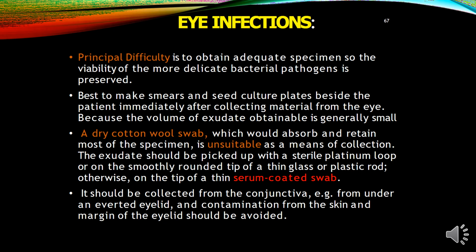Transport is required. In case of eye infection, it is difficult to obtain an adequate specimen from the sample because it is a very delicate area, and the bacteria present in this area are also very delicate. To make the best smears and seed cultures, plate beside the patient immediately and collect the sample from the eye, because the volume of exudate is very small.